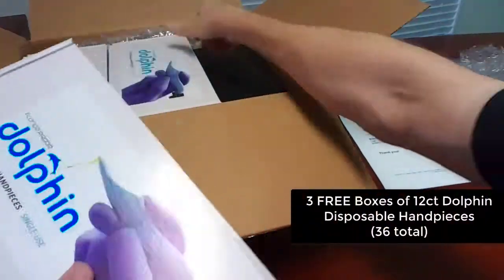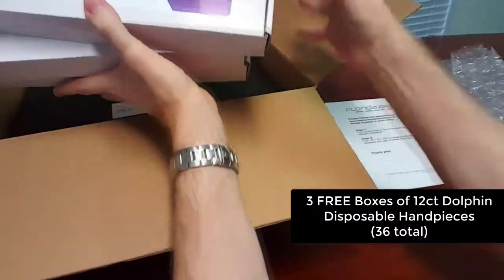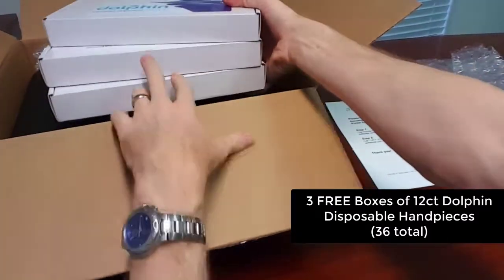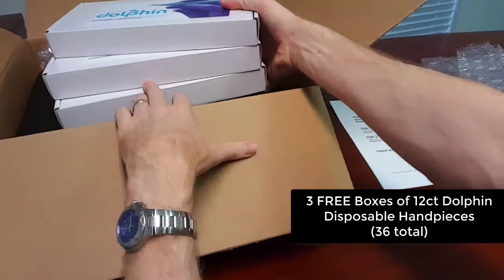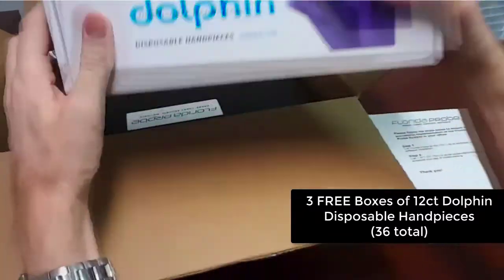There are three free boxes of the Dolphin hand pieces. These 12 hand pieces are one-time use and disposable per box, so there are 36 Dolphin hand pieces to use.